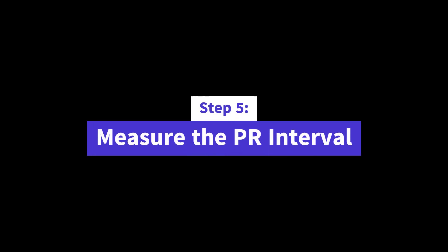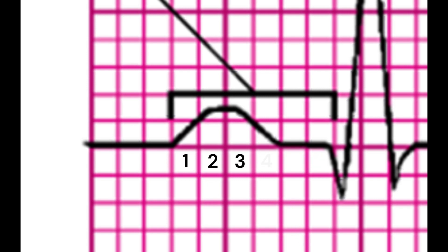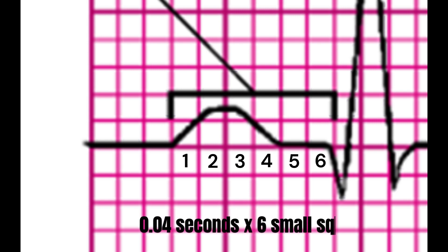Step 5: Measure the PR interval. To measure the PR interval, count the number of small squares between the beginning of the PR interval and the beginning of the QRS complex. You can use an EKG caliper to accurately count the squares.